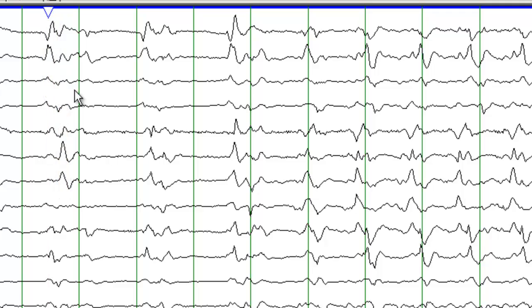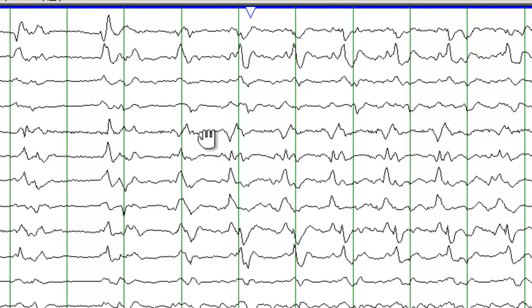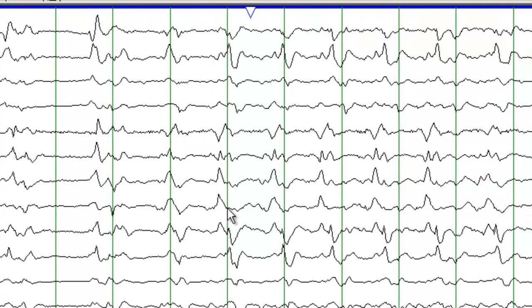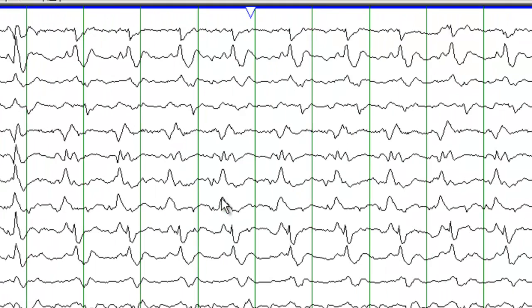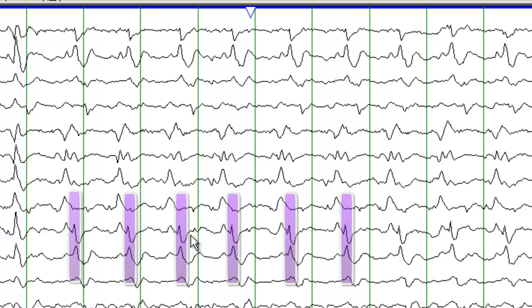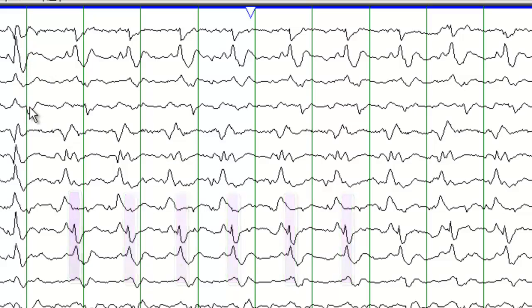Now we have noticed that these are somewhat periodic. So as we progress on this EEG, we see that there is a periodicity there. So these are periodic discharges and these are lateralized to the left hemisphere and the right hemisphere.